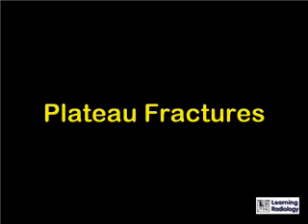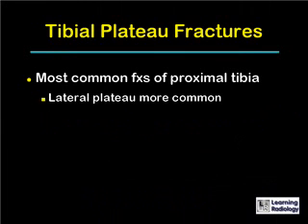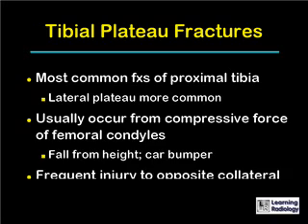Tibial plateau fractures. They are the most common fractures of the proximal tibia. The lateral tibial plateau fractures more often than the medial. They usually occur from a compressive force that is produced by the femoral condyles, such as in a fall from a height or after contact with a car bumper. There is frequently an injury to the opposite collateral ligament.